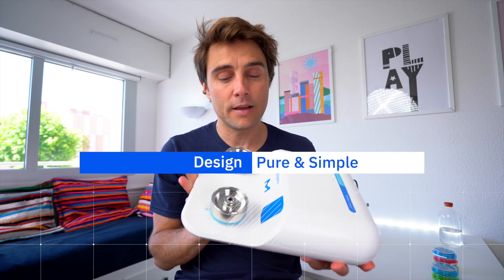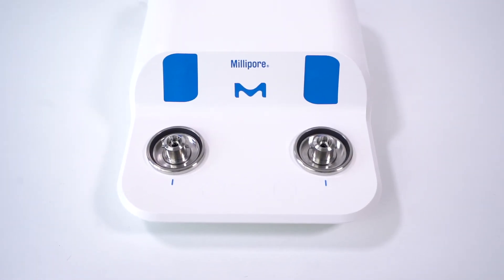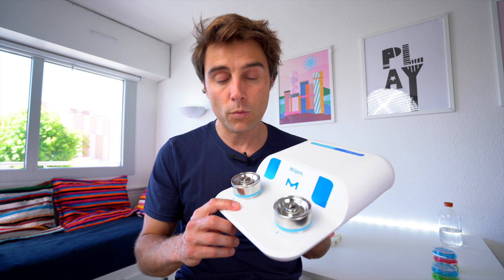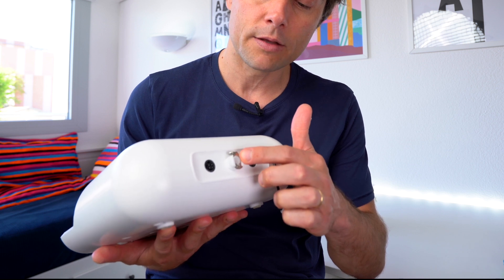So first of all, the design. It's a really beautiful system, really pure, simple, and quite small — smaller than the MiliFlex Plus, the previous version. This design gives you only one button per pump and only two connections: power and something for the liquid waste. And that's it. And it works.